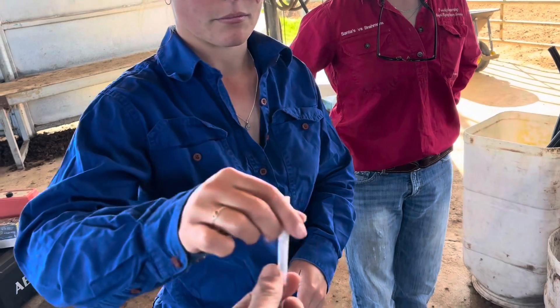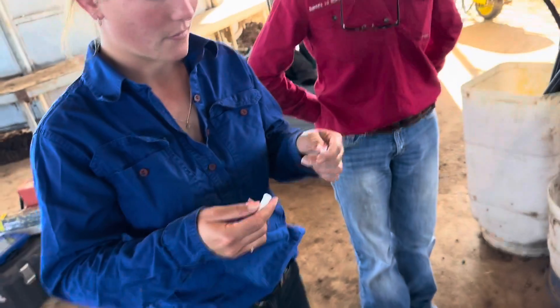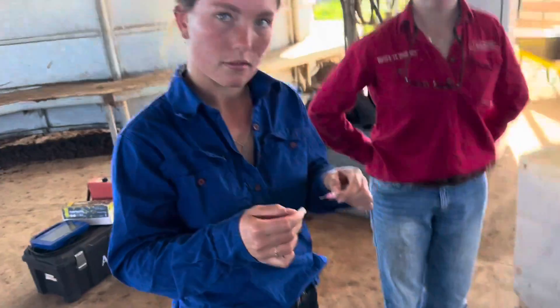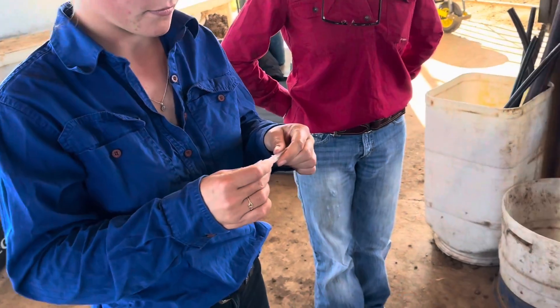Do you want to just break that in half? There you go, Arlie, just split it. When you do, just twist it — because when you pull like that, what happens is sometimes you jerk and then you're likely to stick yourself. So do a twisting motion as you pull it and you're less likely to.